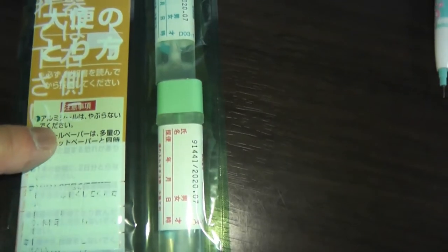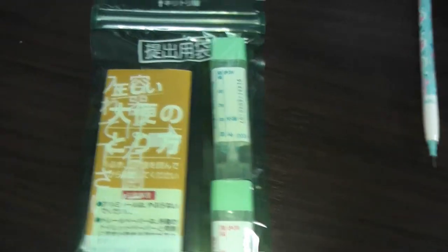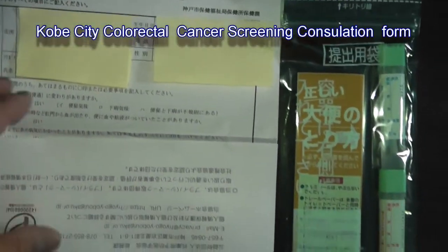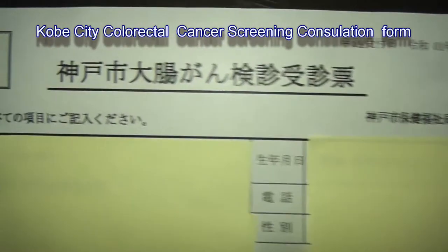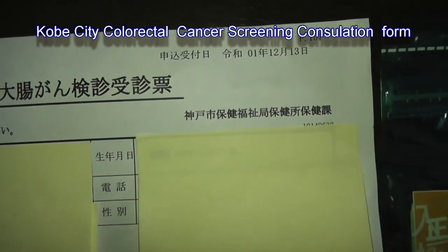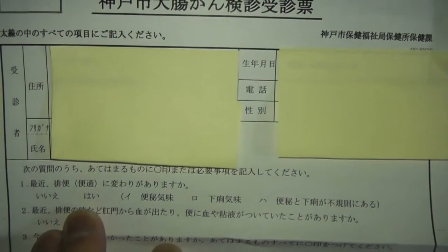Here are the instructions and two sheets of paper. The two vials have two labels that you need to fill out. This form is called Kobishi Daichougan Kenshin Jushin Hyo. When I got this form it already had my printed information on it. There is a medical questionnaire that I need to fill out.